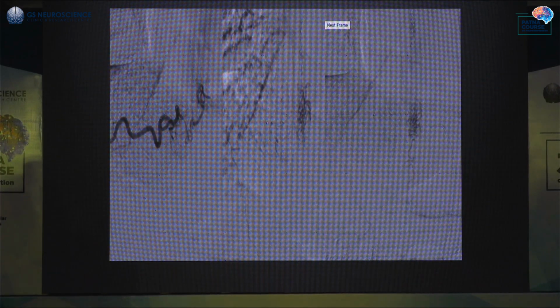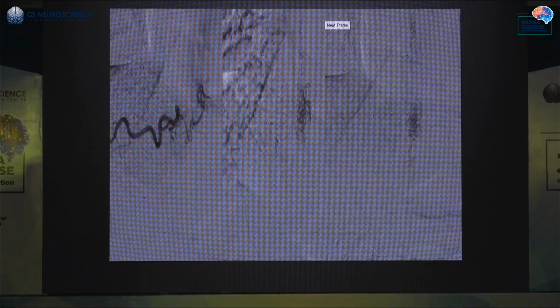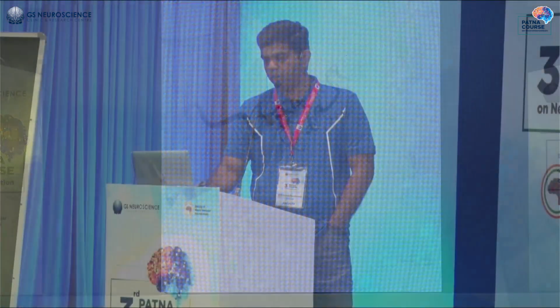And then your microcatheterization. Microcatheterization is what drives it. You need to get really closer to the fistula. Here, the microcatheter injection showing the initial venograms and then the venous outflow. So you need to get your catheter close to the fistula. In this particular case, as you can see here, this is the foot of the vein. Here is your fistulous connection. So you need to get your catheter tip as close as possible to this network for you to be successful. Unless you get this vein, this is going to recur.